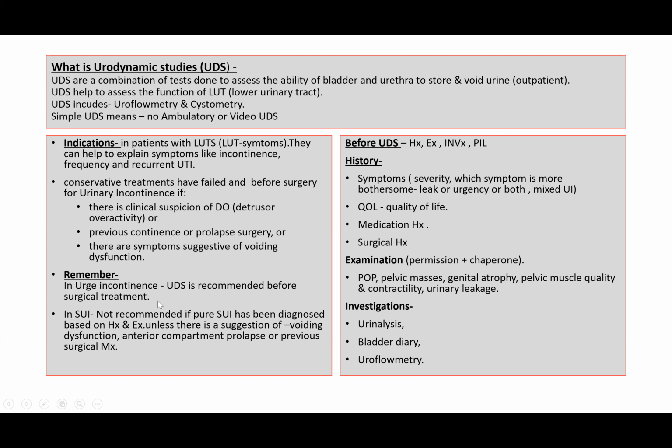We need to remember that in urge incontinence, urodynamic studies are recommended before surgical treatment. But in patients with stress urinary incontinence, urodynamic studies are not routinely recommended, particularly if pure stress urinary incontinence has been diagnosed clinically based on the history and examination. But if there is any suggestion of voiding dysfunction or prolapse, or a history of previous surgery, in that case urodynamic studies can be done in patients with stress urinary incontinence.